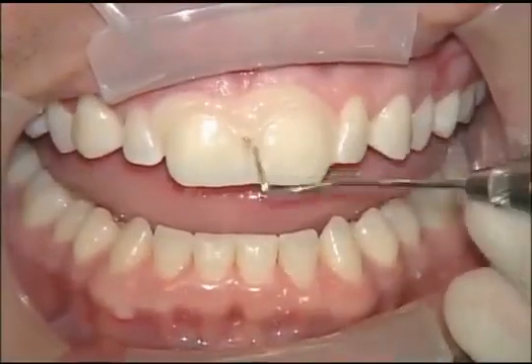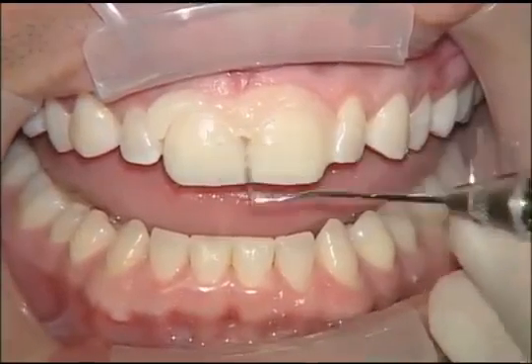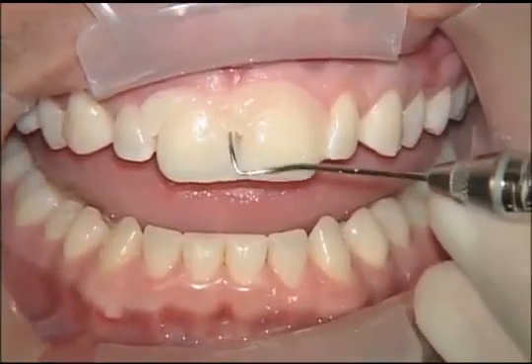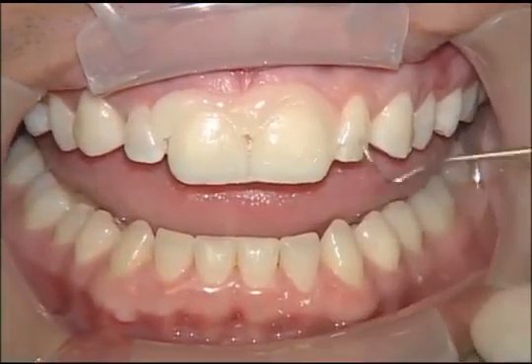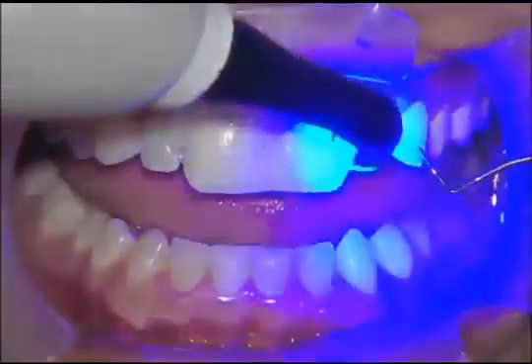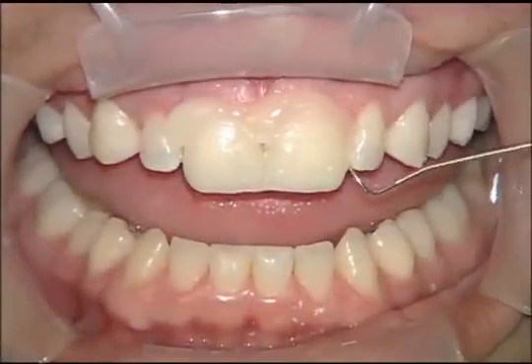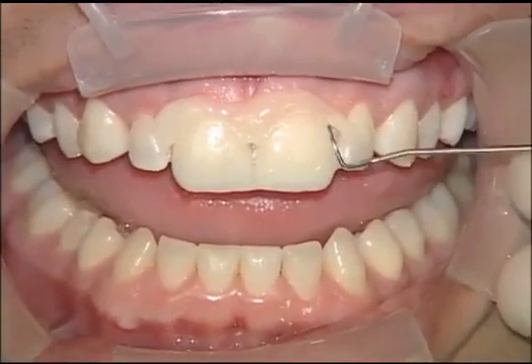And you can see that as I start to work the Explorer under this material, it has gotten to its gel state, which makes it very easy to clean up at this point. The thinner veneer cements tend to run everywhere, and it's a little more difficult. I can see over here on the distal that it's not quite cured yet, so she's going to give me another 1.5 seconds, 2 seconds, and we're going to see, and that appears to have set it up. So we'll go ahead and be able to remove this in one big piece.